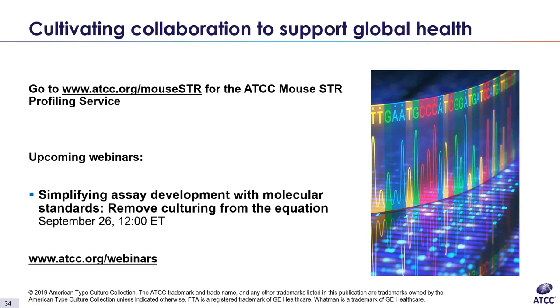It's really best to adopt the seed stock principle, where you have a master cell bank, and then you set up a working cell bank from that, and you take aliquots from that. It's best to keep returning back to low passage stocks. That's what ATCC does, basically. Generally speaking, we recommend passaging a culture no more than 8 to 10 times or 2 months. Great.